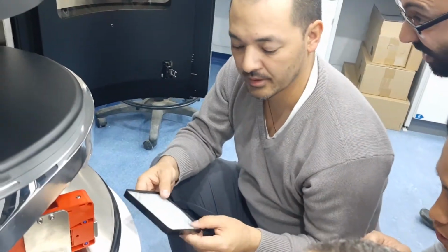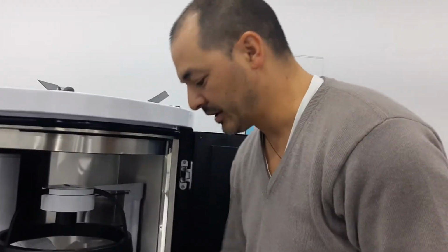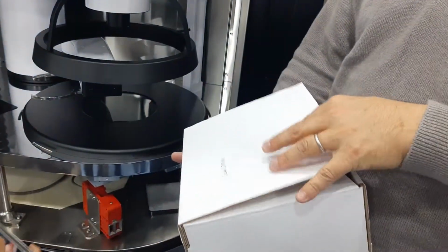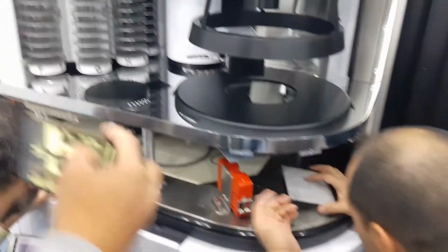I think in the box we provided you with a few filters. To change those filters, you don't need to take off the middle panel. Just take the small panels there and you can access it, even if it's not that easy. You have a few, I don't know how many, but just change them. They do get a little bit dirty after 1 year. There's another one on the other side too. It's just clipped.